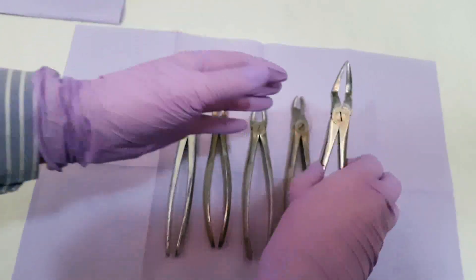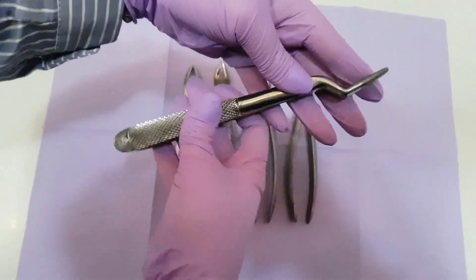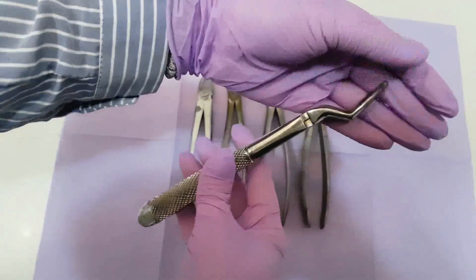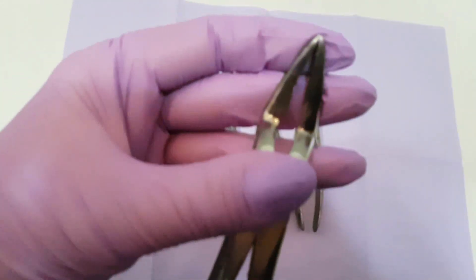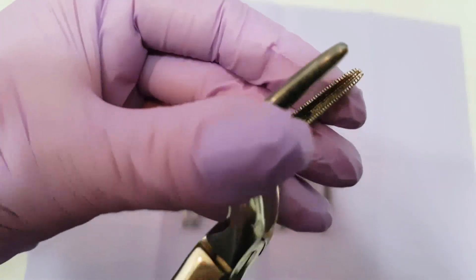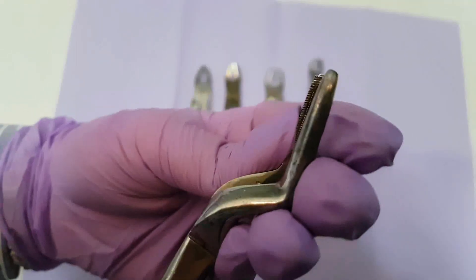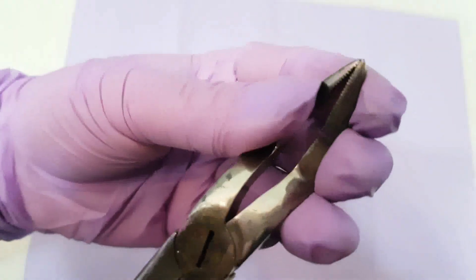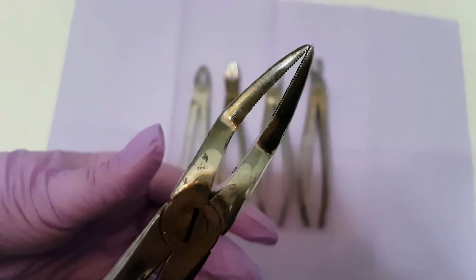And last I want to show you the forcep that is used to extract roots that are stuck in the tooth alveola because they are broken for different reasons. The working handles are formed at an angle and close all the way so we can properly extract the root from the tooth alveola. This is also called the bayonet forcep.